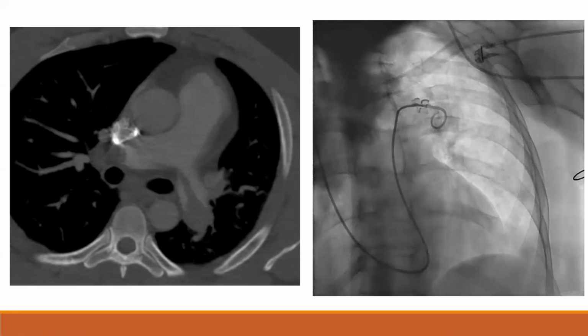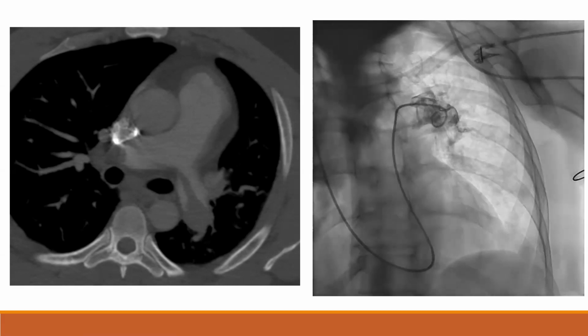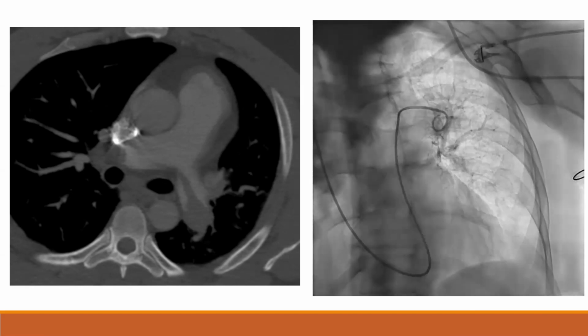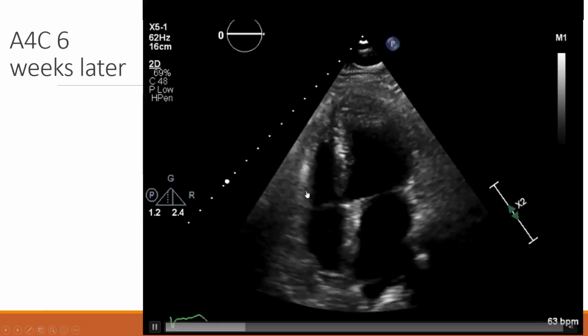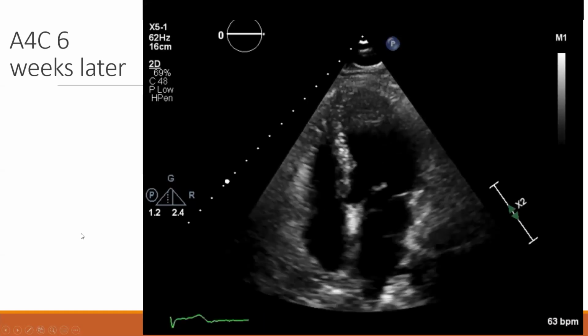This patient actually went for invasive pulmonary embolus therapy, which I know is a little bit controversial, but as we're starting to recognize which patients may benefit from that therapy further, echocardiography can play a key role. And 6 weeks later, you can see this patient's RV is normalized.